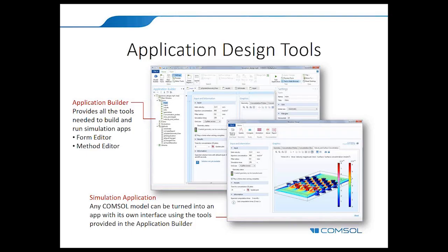In your model, anything that's parameterized can become an input in an app. Then the value is selected by its user. The application builder features a form editor that allows you to customize the app's user interface by adding any input fields, graphs, tables, and many other features that are relevant to your model. An example of an app based on the biosensor model is available in the application libraries, and it's shown right on this slide. There's also a method editor that allows you to further customize the simulation app designed in COMSOL, so there's a lot of flexibility there if you want it.